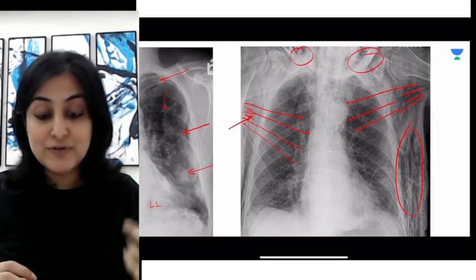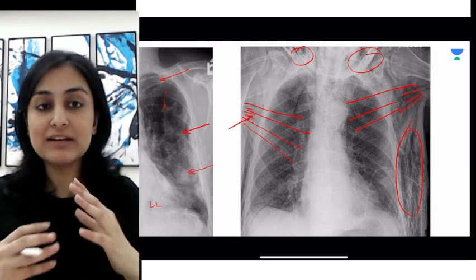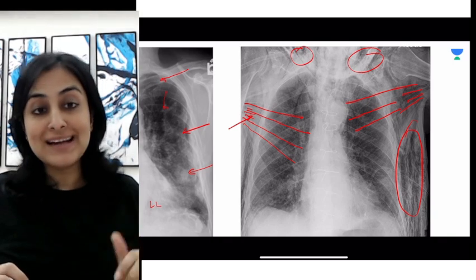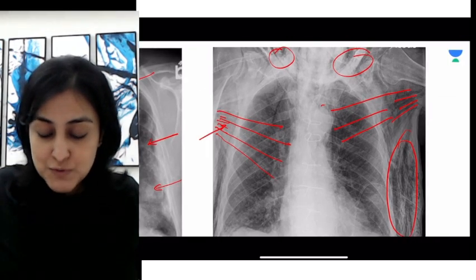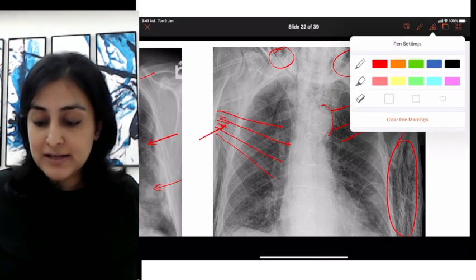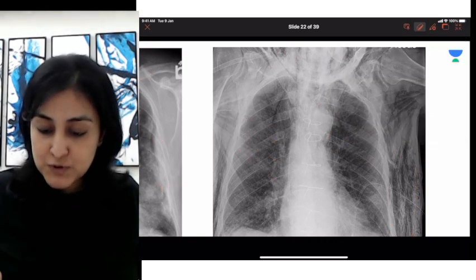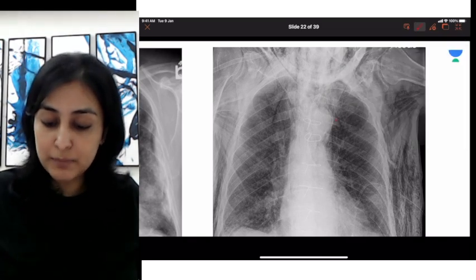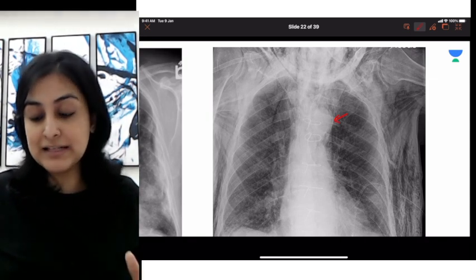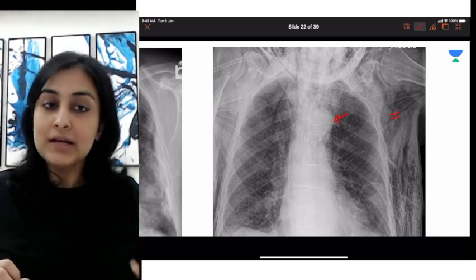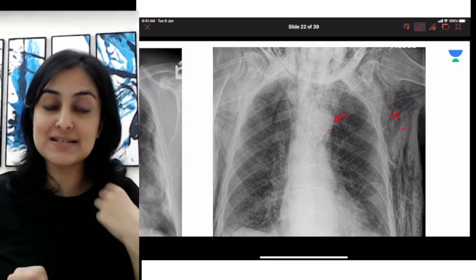Where do we see subcutaneous emphysema? It is very frequently seen in trauma. In trauma cases with airway injury and air leak, air gathers into the subcutaneous plane. Apart from that, any time you have pneumomediastinum — if you focus carefully you can see air around the aortic knuckle — this is the ring around the artery sign of pneumomediastinum. Pneumomediastinum can lead to subcutaneous emphysema, or pneumothorax can also lead to pneumomediastinum as well as subcutaneous emphysema.